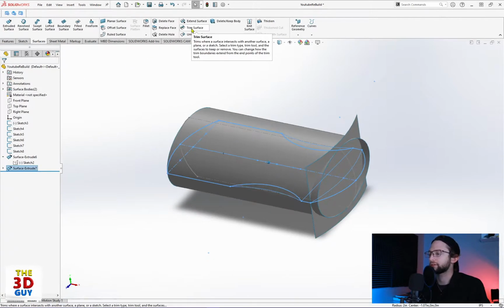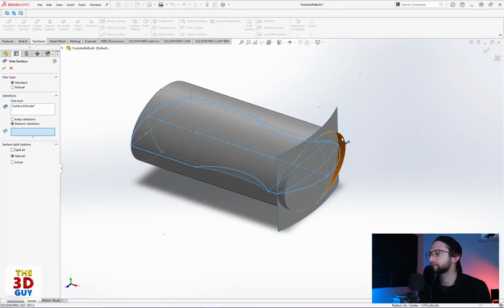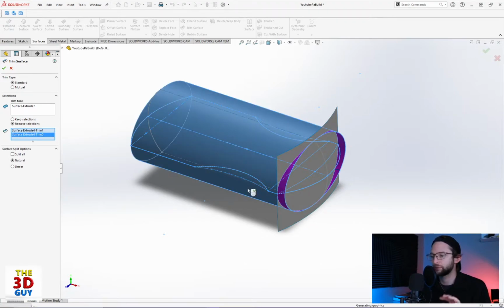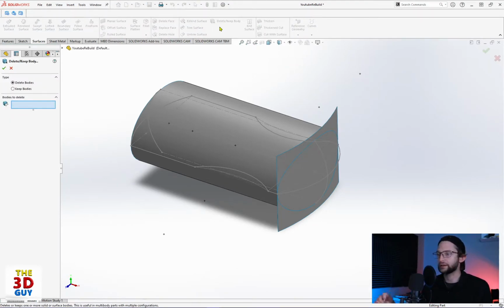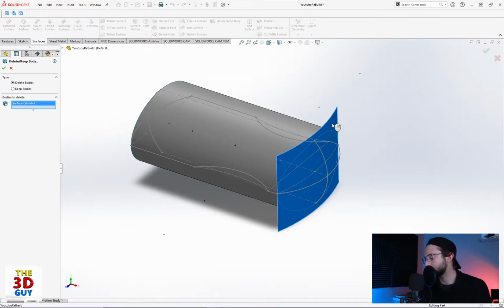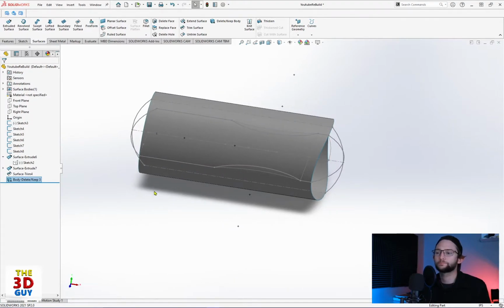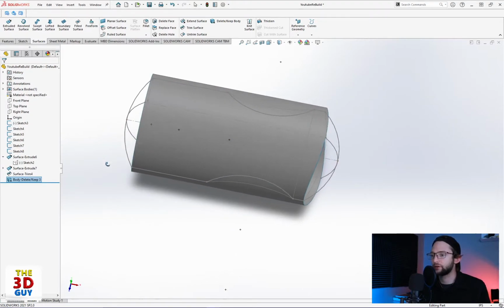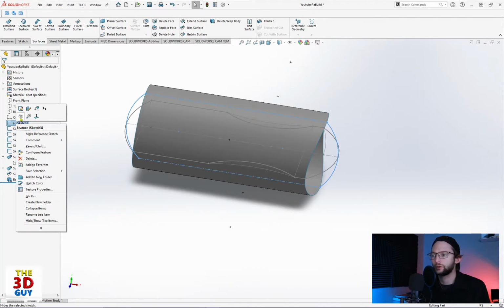And I've actually been really impressed with how simple surfacing really is. I mean, it is different. It is definitely a different beast than just typical modeling. But it is not that bad once you get the hang of it. Something that's unique for how I have set up, I have this feature set here. I added it. It's not a default setting. In surfacing, I use it frequently. And so I like having this delete keep body feature personally. That's just a little preference that I have. So I'm actually going to make these standard top and side views disappear as well, just so I don't get them confused and not accidentally click on the wrong one.